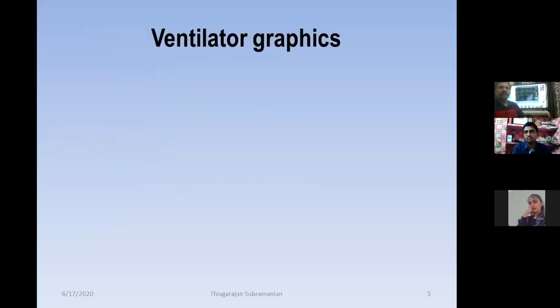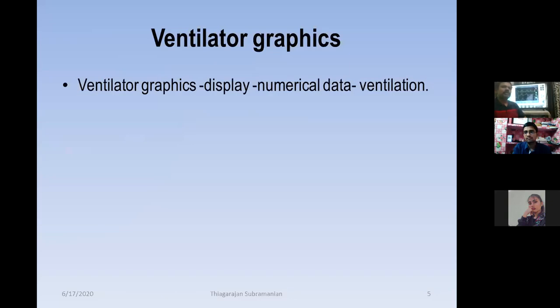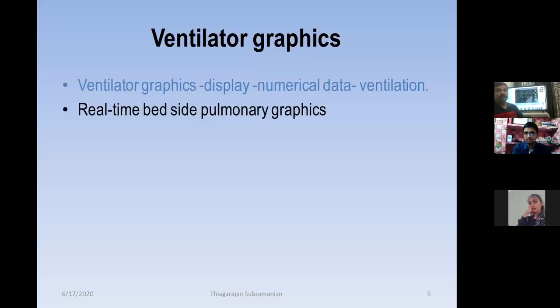So usually with ventilator graphics, we have to find out a few data from the numerical part of the ventilator about the lung ventilation. These are the few points always displayed in the graphics of the numerical data during ventilation. In real time, bedside pulmonary graphics have become standard care in most of the ICUs. Most of the information presented by these graphics is in real time, with a continuous display, and it is not only a snapshot of the previous pulmonary function. So it is always an important thing to remember.